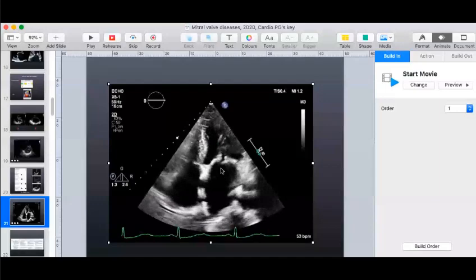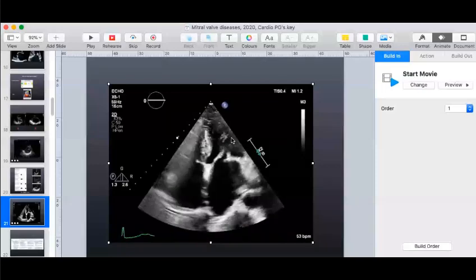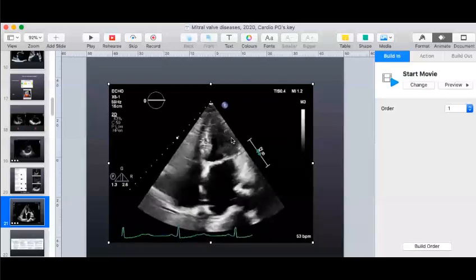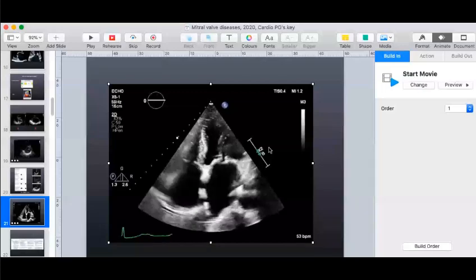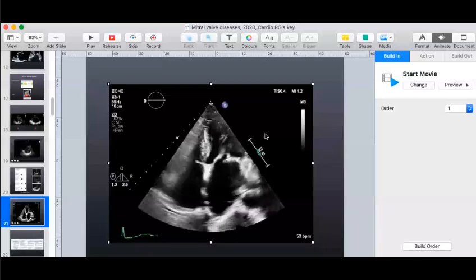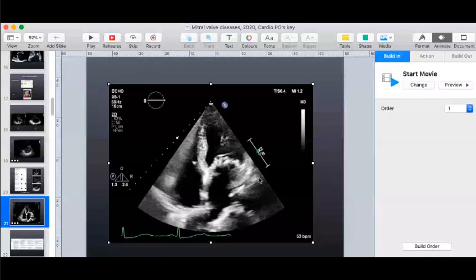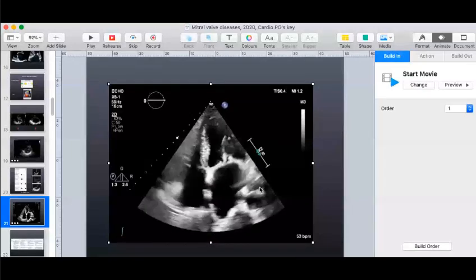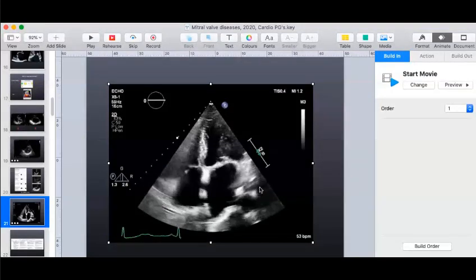The LA cavity is not showing a thrombus, but the LA appendage is not well seen, so I can't comment on the LA appendage. Okay, where would you see the LA appendage in this particular view? Give me a rough direction. Where would the LA appendage be visible in the four chamber view? You're correct, but let's get the anatomic location of the left atrial appendage. It will be below the left superior pulmonary vein, just above the mitral annulus.